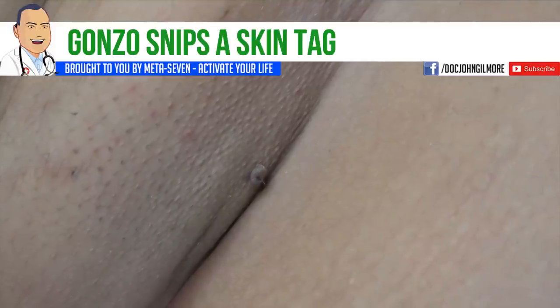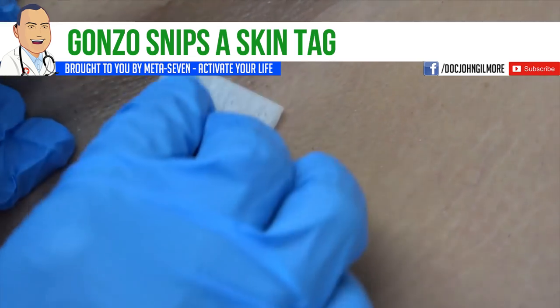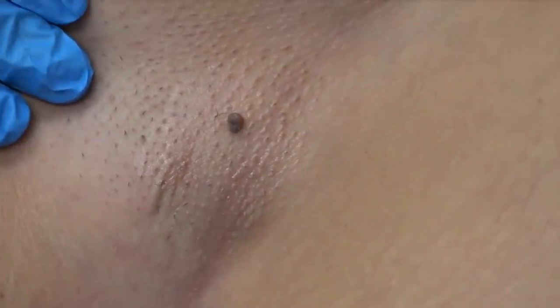We have Misty helping Dr. Gonzo. Hi Misty. Now Misty, why don't you go ahead and pull that skin back a little bit and hold that right there. Oh, we've got a really good shot of this. Hey Dr. Gonzo, how are you today? I am awesome.